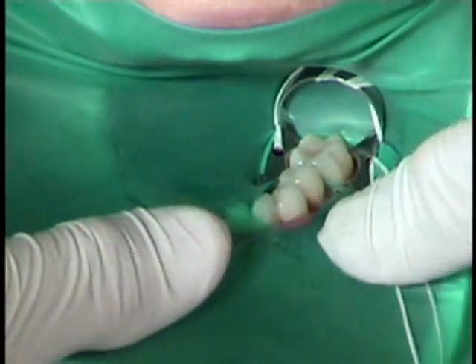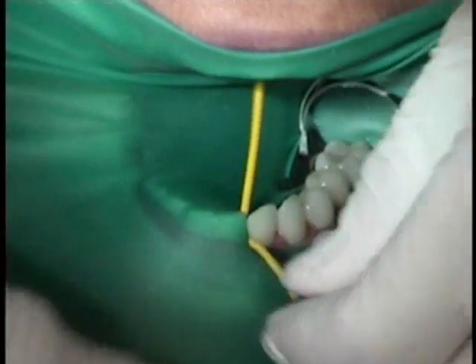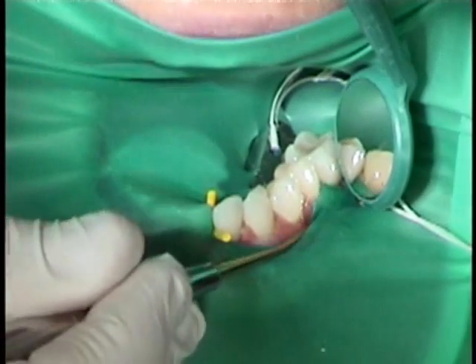The dam is then stretched anteriorly and anchored with a wedged cord. The dam is stretched off the wings, then wax floss is used to pass the mesial dam on the anchor tooth interproximately.